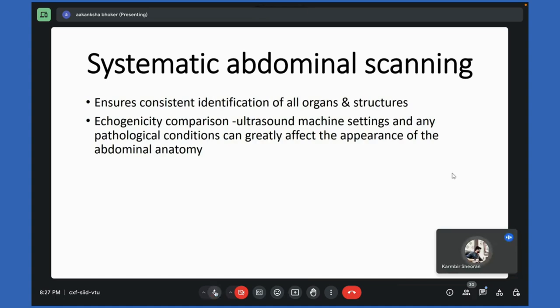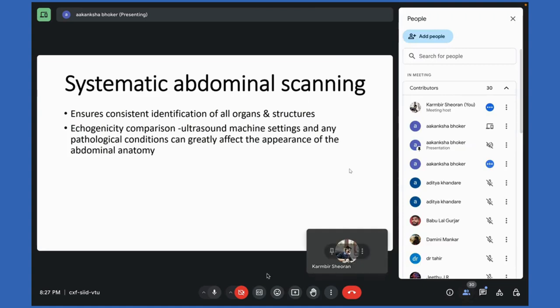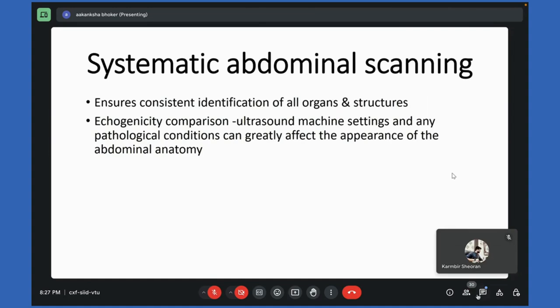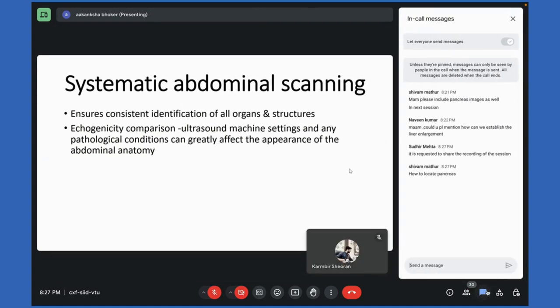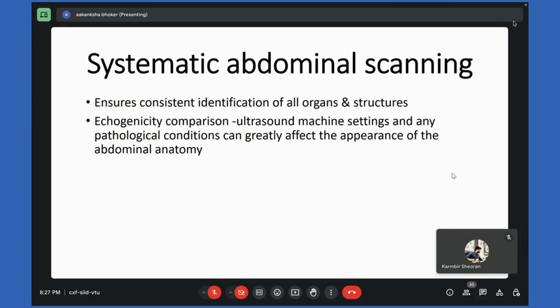Ma'am, one more question. How to locate the pancreas? Okay. The pancreas is a little bit tricky, but for locating it, you have to scan from the right side. There are two parts, the right limb and the left limb of the pancreas. You have to scan from the right side.